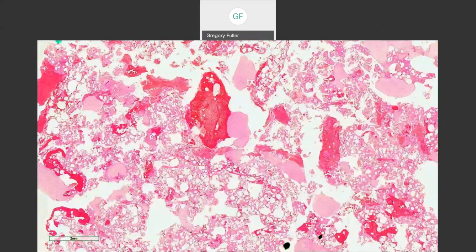This is the surgical specimen. Yeah, gyriform calcification, Dr. Harb, exactly. All right, what type of surgical specimen are we looking at? You notice all the blood, you got chunks of tissue, and you have all of the bubbles. Yes, Dr. Gilbert, Andrew Gilbert, neuropathologist, San Antonio. Dr. Alfatal, CUSA, absolutely. This is cavitational ultrasonic surgical aspiration, all right?